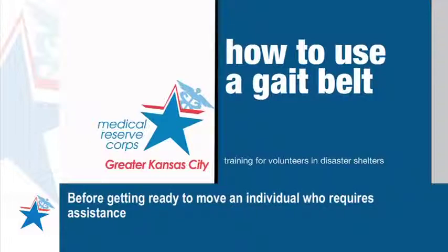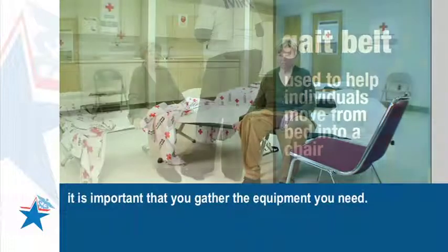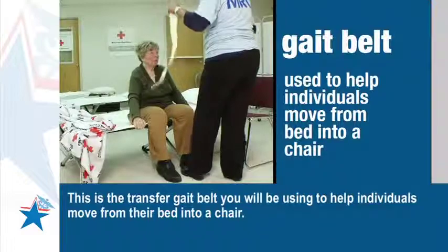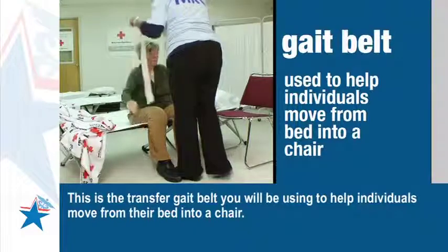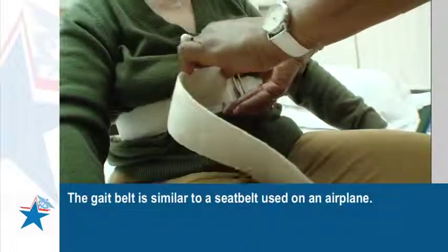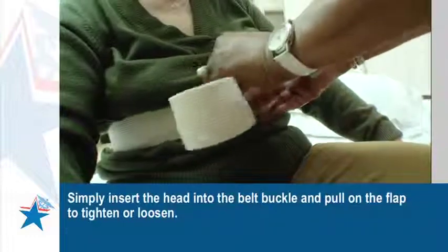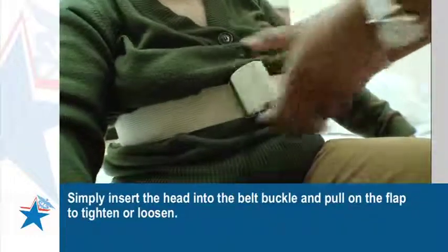Before getting ready to move an individual who requires assistance, it is important that you gather the equipment you need. This is the gait belt you will be using to help individuals move from their bed into a chair. The gait belt is similar to a seat belt used on an airplane — simply insert the head into the belt buckle and pull on the flap to tighten or loosen.